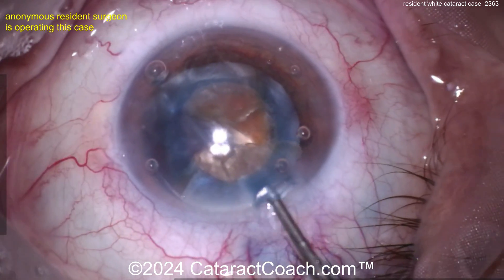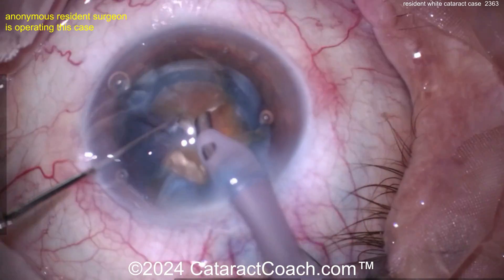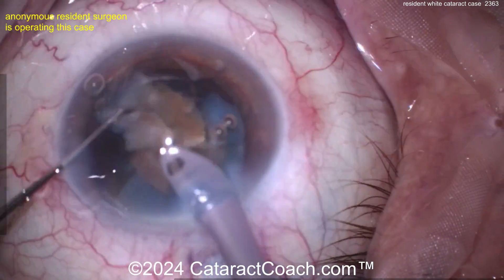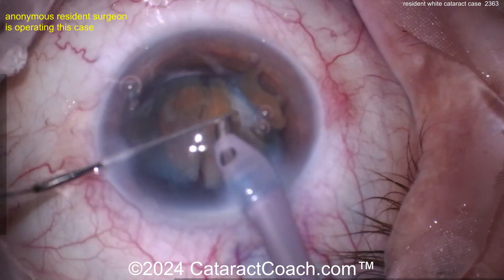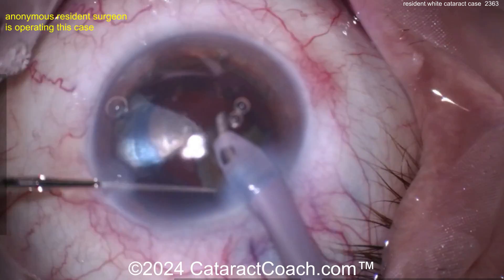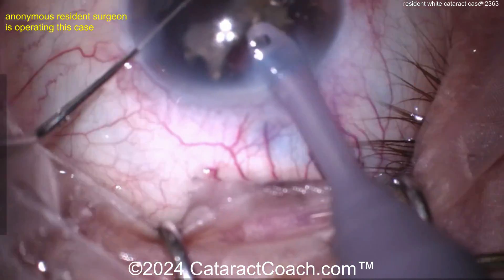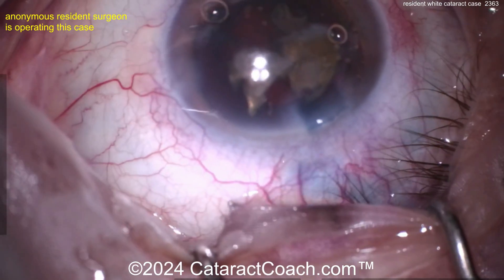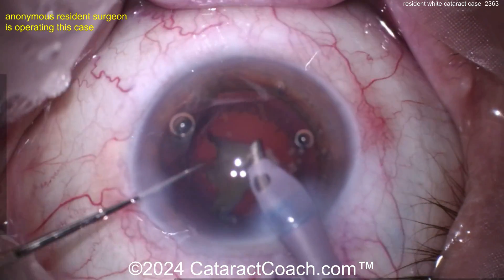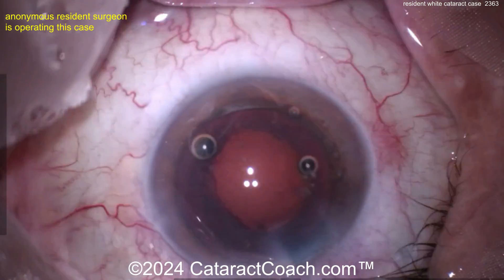Coating the endothelium with viscoelastic — smart move. If I was just going to guess: the lashes make me think you've done fewer than 50 cases; the incision suggests a couple hundred; the rexis about a hundred; the phaco chop technique about 500 cases. You've certainly got good hands and good experience. Look at that efficient removal — and remember, this video is sped up to 4x normal speed. The surgery was about 25–30 minutes, but the technique is great, hands are good, beautifully done.